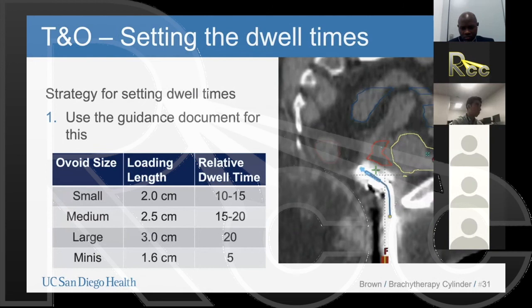That's right. So don't take this out of context, but always consider that in the context of your specific equipment and hold up a ruler to it. Convince yourself this is long enough and I can use that loading.